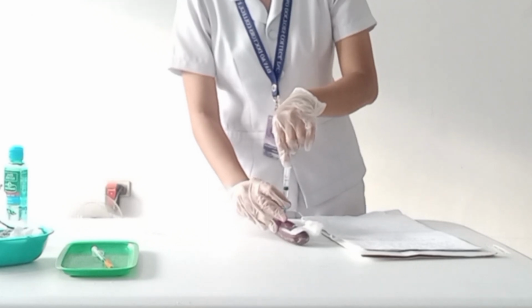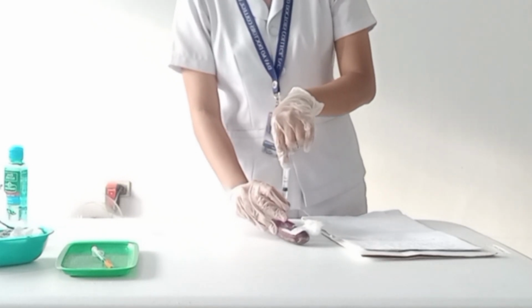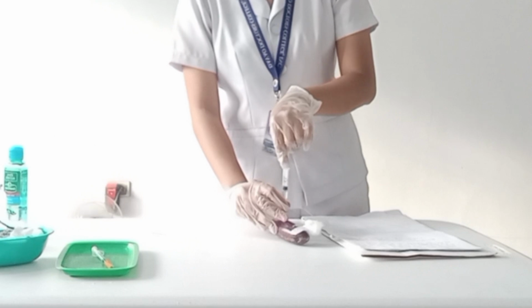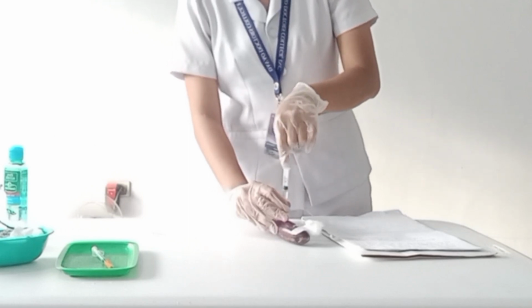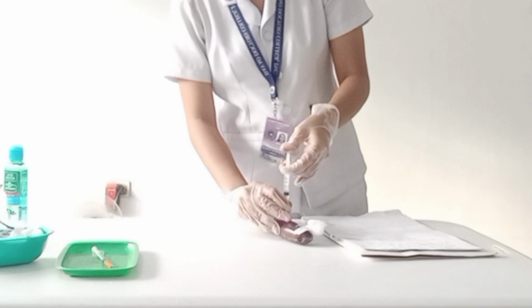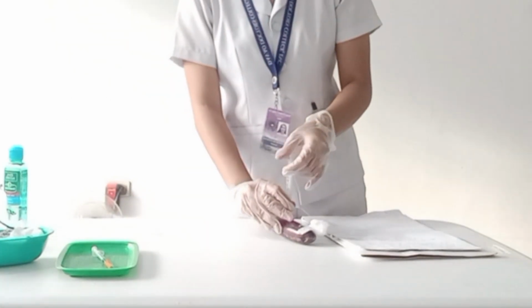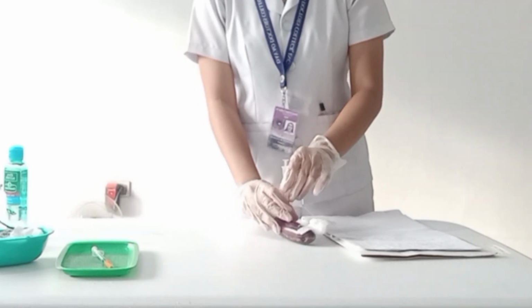So this step determines whether the needle has been inserted into blood vessels. But if there is no blood, inject the medication steadily and slowly. So now we withdraw the needle smoothly at the same angle of the insertion to minimize tissue injury.